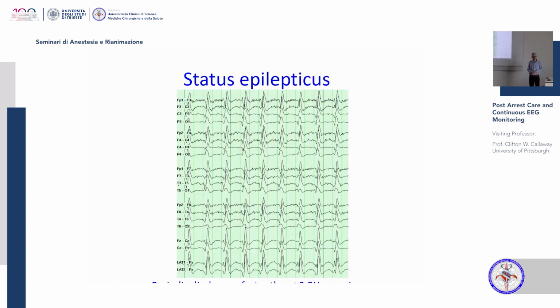If GPEDs happen fast enough, the operational definition is to call it status epilepticus, to call this a seizure. It's shades of gray. So I showed you GPEDs earlier that were maybe happening once per second. If they start happening two or three times per second, it's called a seizure. I refer to that as a statutory seizure because it's by definition. It doesn't quite look like the evolution that I showed you for the more classic seizure, but we think this is something that we would consider on the same spectrum as a seizure.